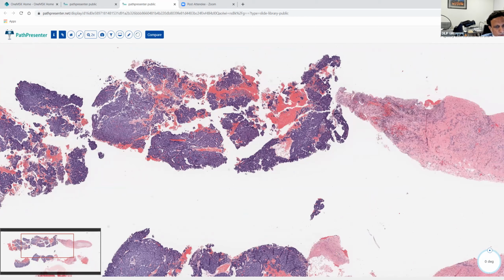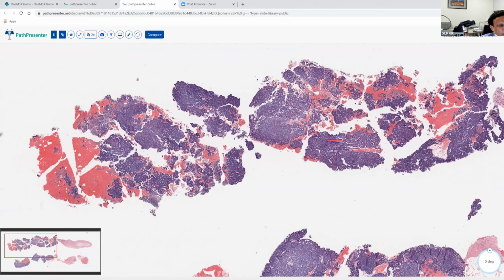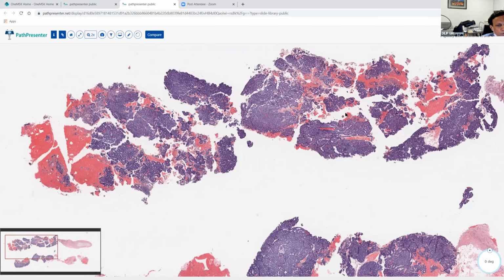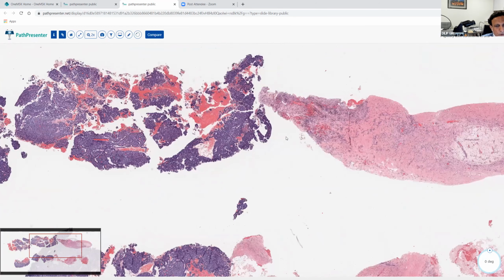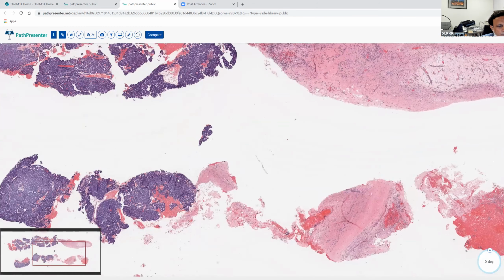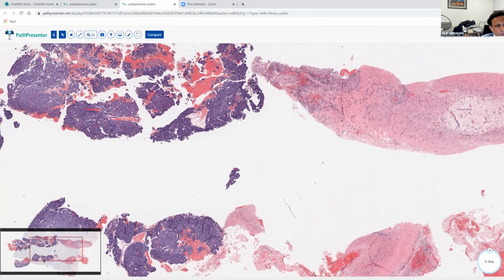Now, I don't know in this core biopsy whether this is going to be invasive or not, right? So instead of trying to say that there is no evidence of invasion or this is papillary DCIS, in a situation like this, the best way would be fragments of papillary carcinoma, and the next line would be, due to fragmented nature, invasion cannot be assessed. And that's fine.